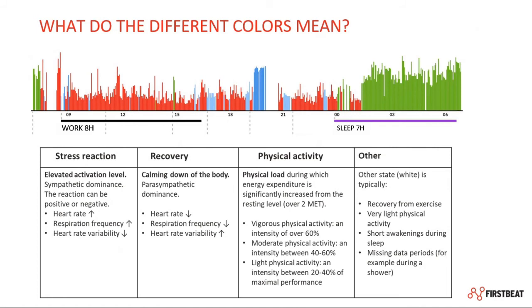Physical activity means physical load during which energy expenditure is significantly increased from the resting level. It can be light blue or bright blue. Light blue meaning light physical activity where the intensity is between 20 and 40% of the maximal performance for that individual. Whereas the bright blue means moderate or vigorous physical activity where the intensity is going to be higher.